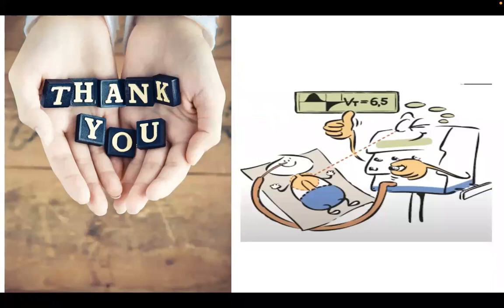But I think the VN series ventilator has become a game changer. If 80% of the leak is compensated by this type of ventilator, you just intubate the baby and put in an appropriate size tube, and whatever the leak is, it will be compensated. Another important thing is that, all of you who are watching this meeting, when you intubate a baby, sometimes you find that the leak changes in different positions. Suppose you keep the baby on the left lateral, there will be 30% leak, and if you change the baby to the right lateral, there will be no leak.